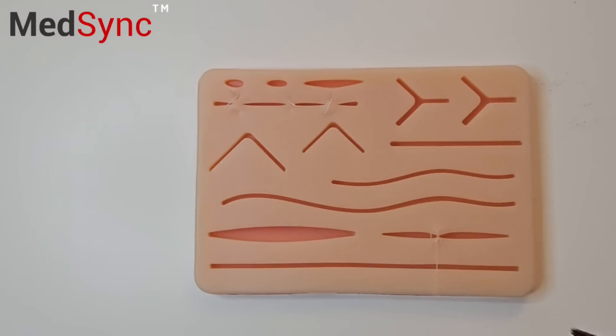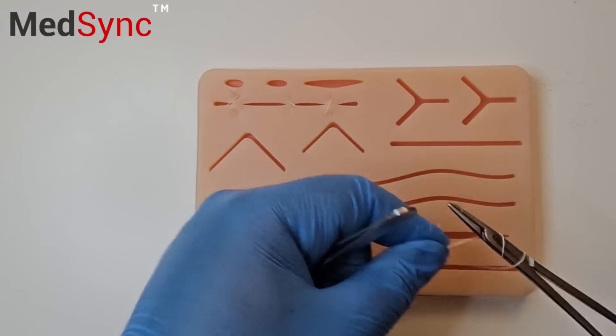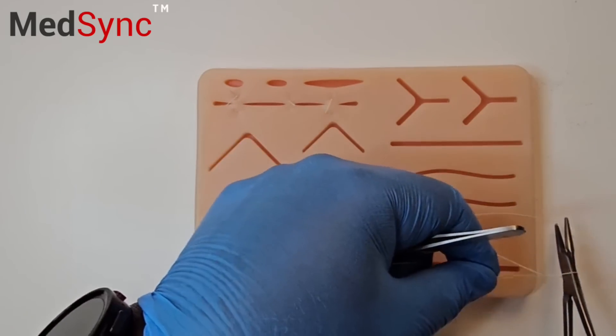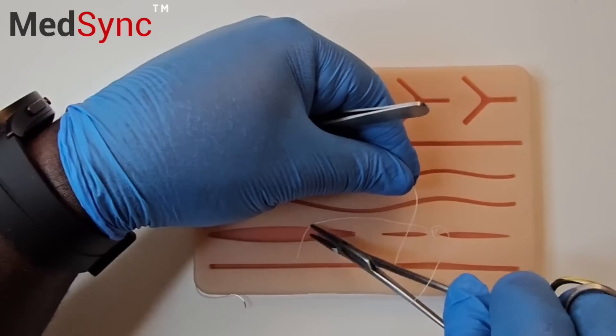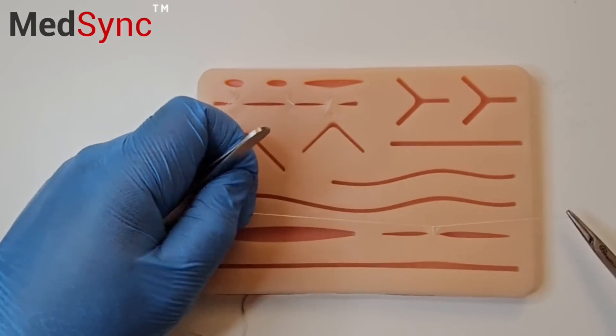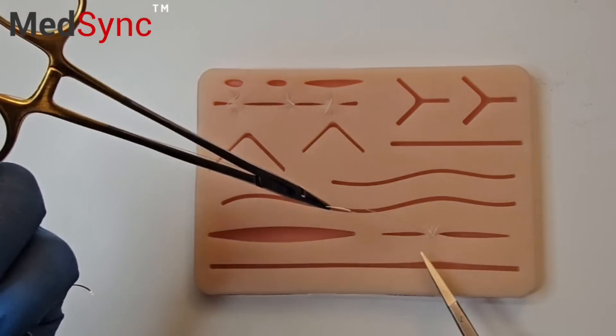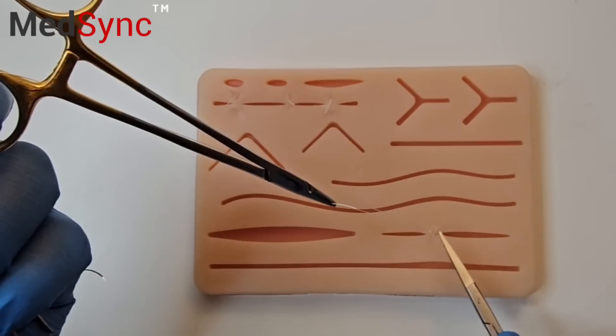Now tie your normal knots — a surgeon's knot, a reef knot, and another reef knot. This allows the tension to be distributed more evenly over a larger area on top of the skin.